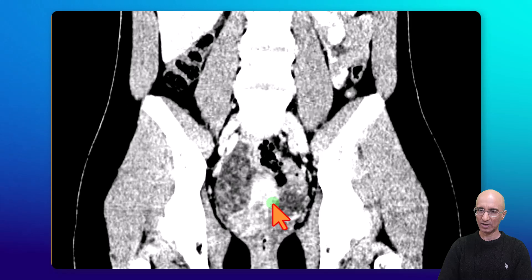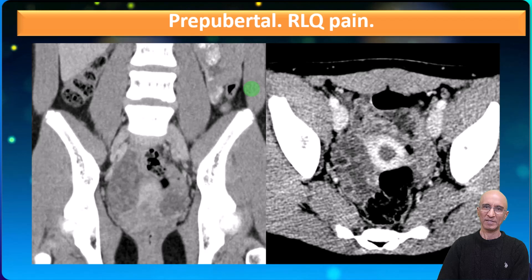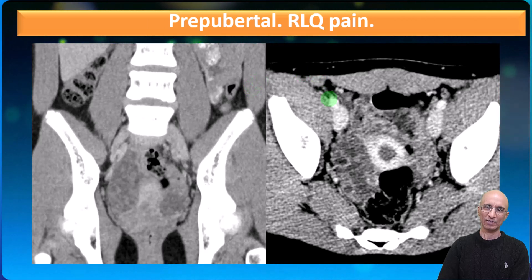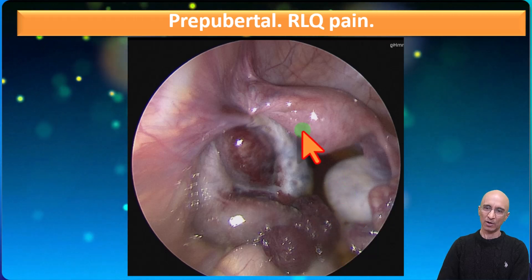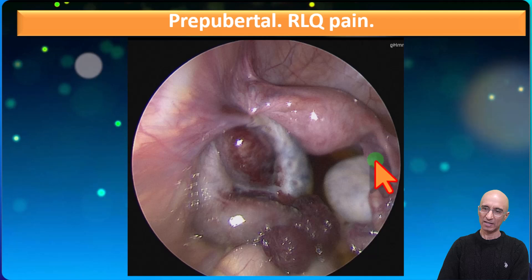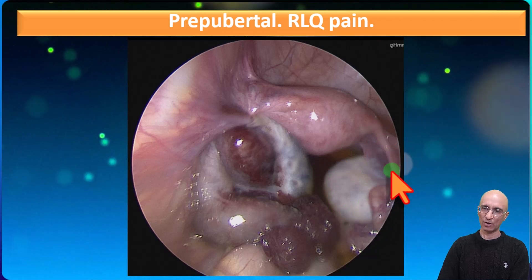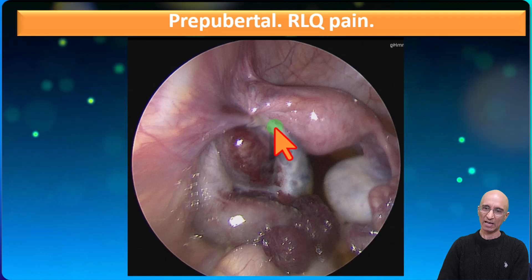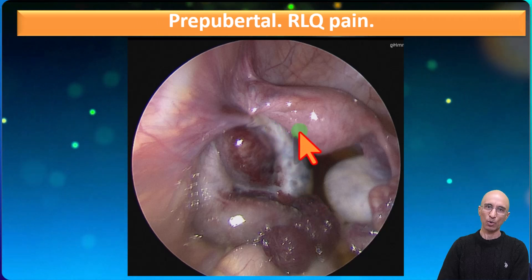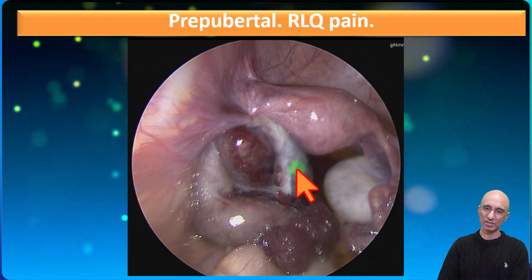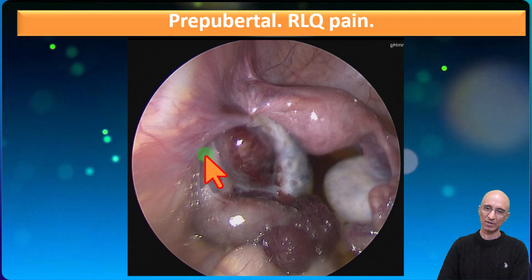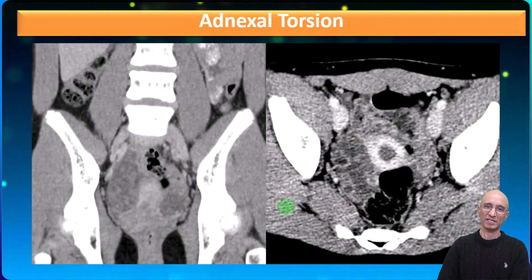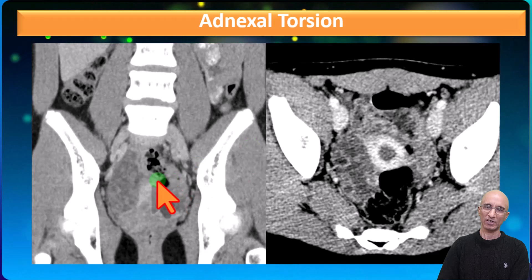Contrast this to the normal-sized left ovary with few follicles. Imaging appearances are highly concerning for adnexal torsion. The patient was taken to the OR for further management, and on the laparoscopy images we can see a normal appearing left ovary and fallopian tube, contrasted to the right ovary which is abnormally positioned posterior to the uterus and has a bluish tinge. Also, we can see a dilated tubular structure adjacent to the right ovary. Imaging appearances are consistent with tubo-ovarian torsion.